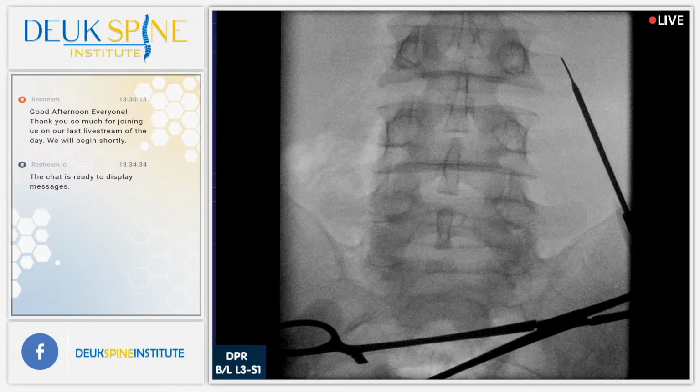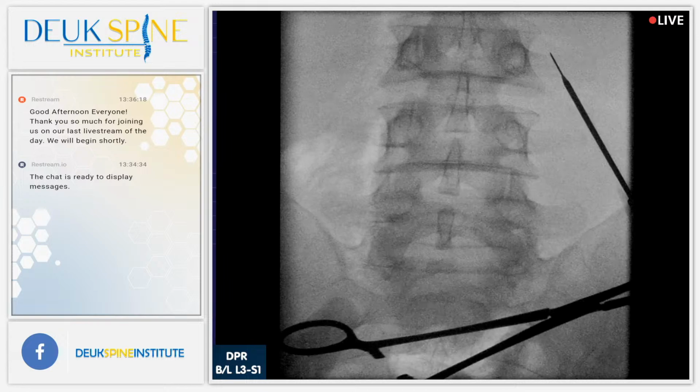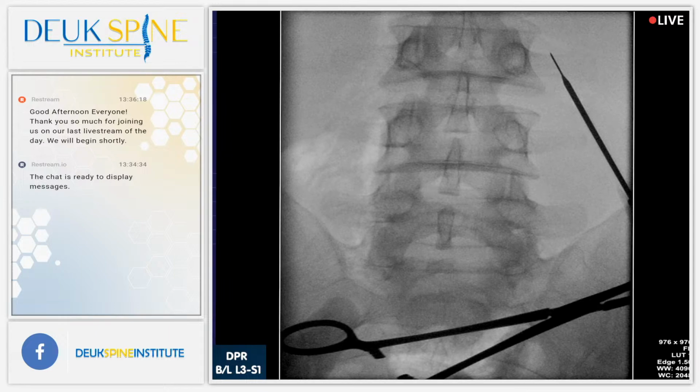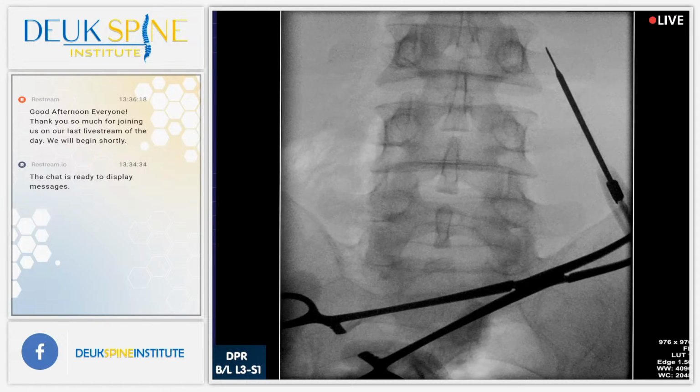That feels good. Still feeling bone. How's he doing? Great.